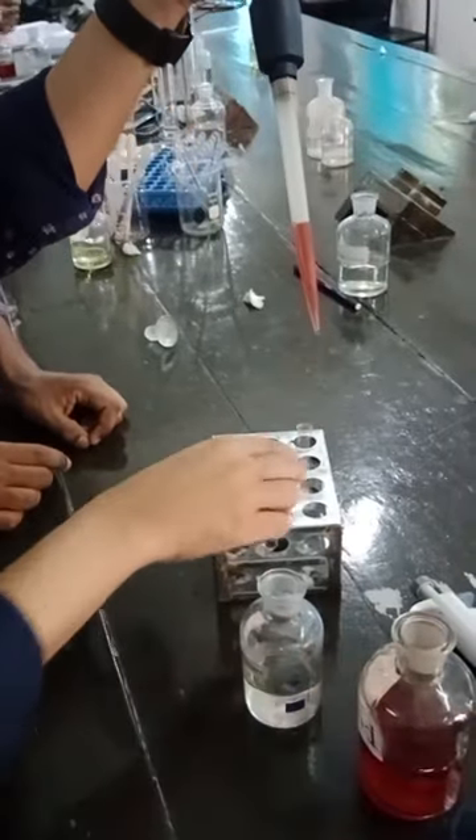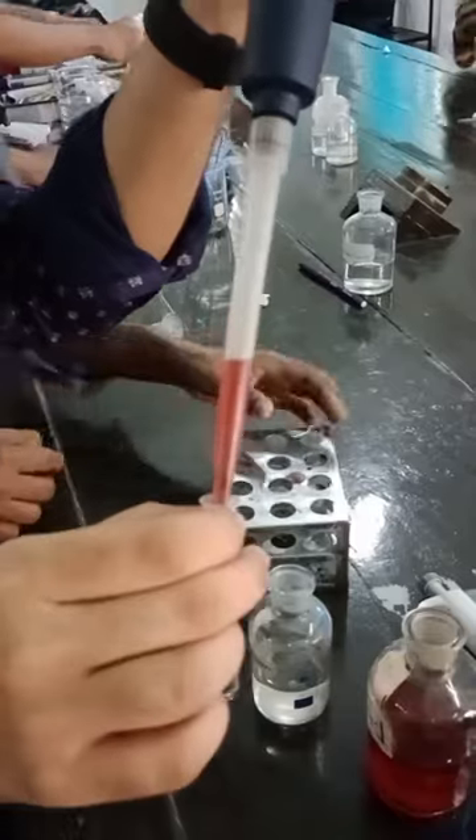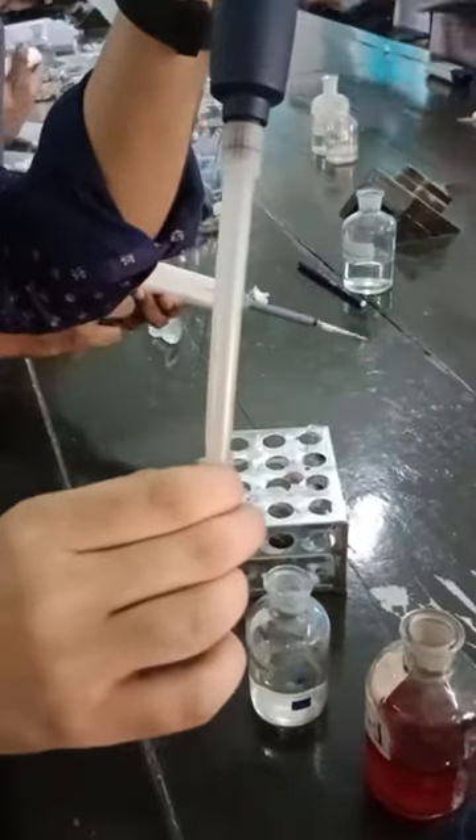And then take it into the test tube — one press or two press is enough. Then shake it: one, two, three — done.